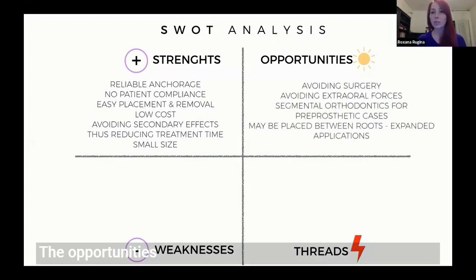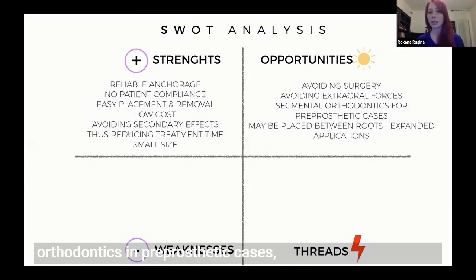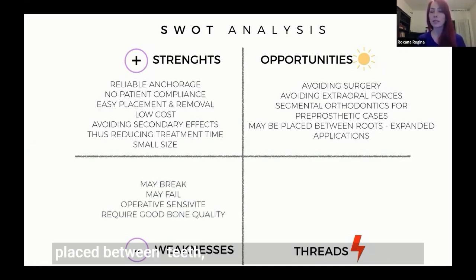The opportunities: we may avoid surgery, extractions, and extraoral appliances. We can use them very easily in segmental orthodontics and in preprosthetic cases. And they are very easily placed between teeth exactly where we want them.